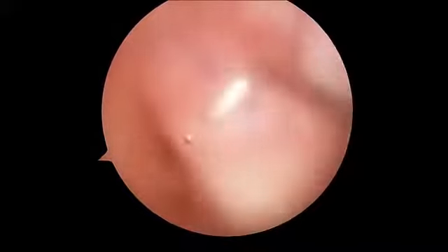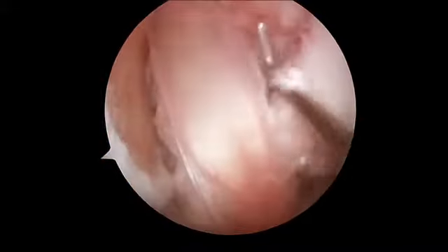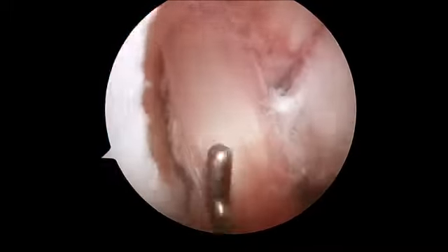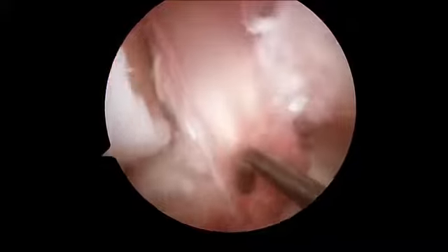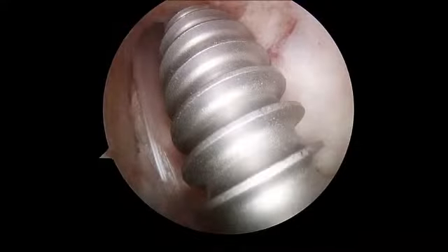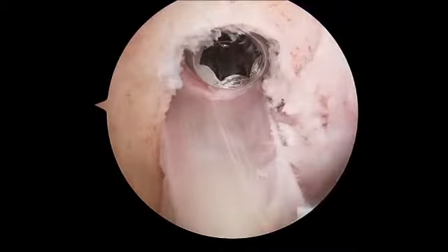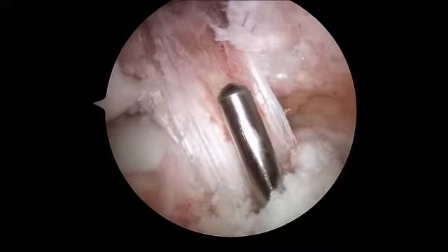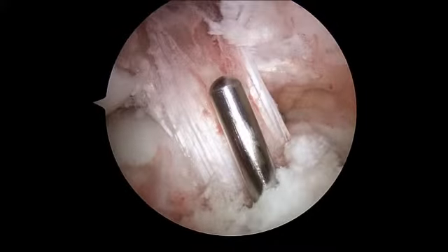You can see the bone plug sliding up into the femoral tunnel. Here's our new ACL. Looks very, very nice. It's nice and snug and tight. It's not getting hit on by the notch towards the outside. And then we place a 7 millimeter by 25 millimeter screw in the bone tunnel. You can see the screw head up there now, and it's crammed into that tunnel, a 7 millimeter screw, a 10 millimeter bone plug. And now we place a screw in the tibial tunnel as well.